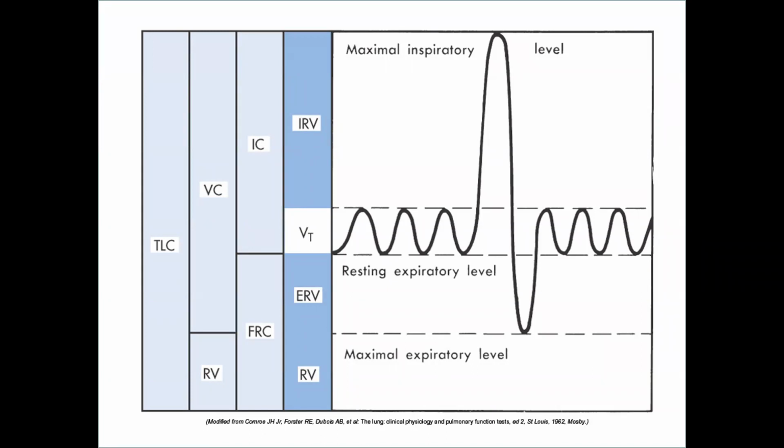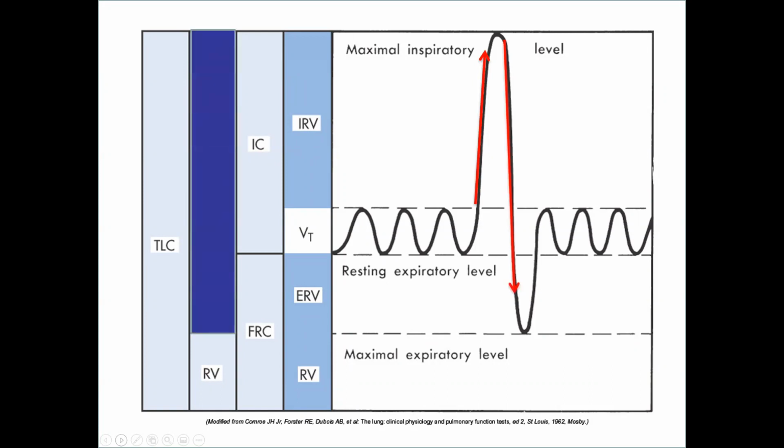Again, you can yell at them, but you don't have to necessarily do all that. Just make sure that the coaching is really what's critically important. It's less about the screaming. You may instill terror in their hearts by screaming at them, so probably not a great idea, but really coach them clearly and, if you will, authoritatively. Out, out, out, all the way out. That right there.